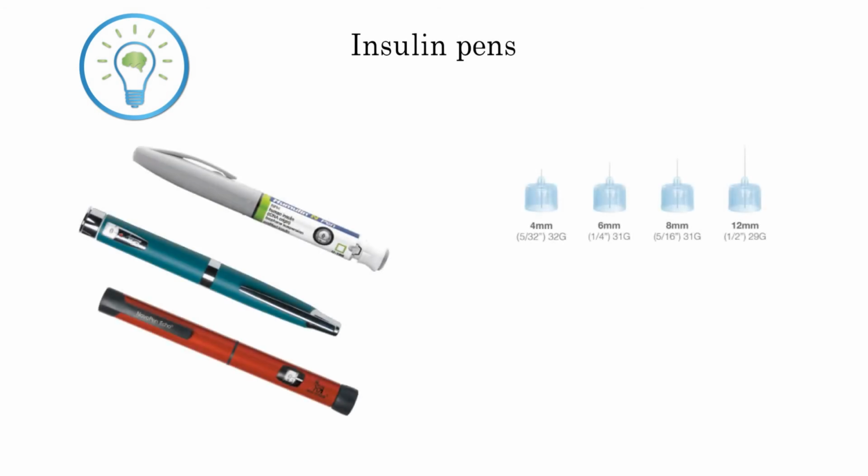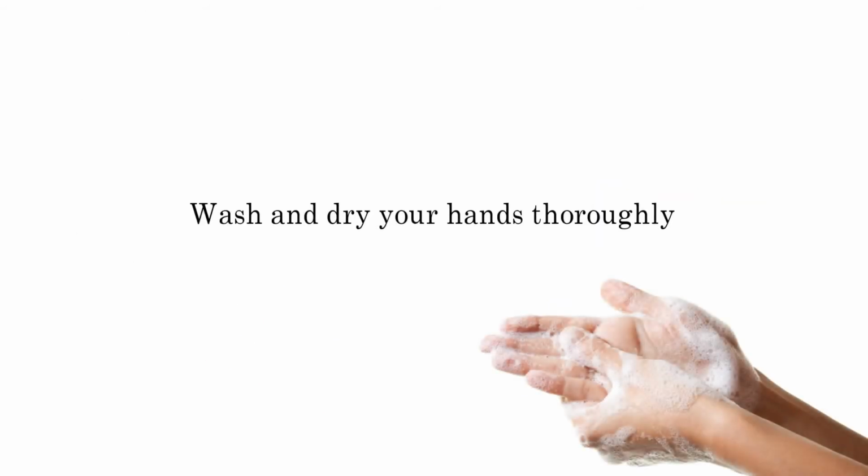Insulin pens. Insulin pens make the injection process easier for many patients. Although there are many different types and brands, these pens allow for easier and more accurate insulin administration.